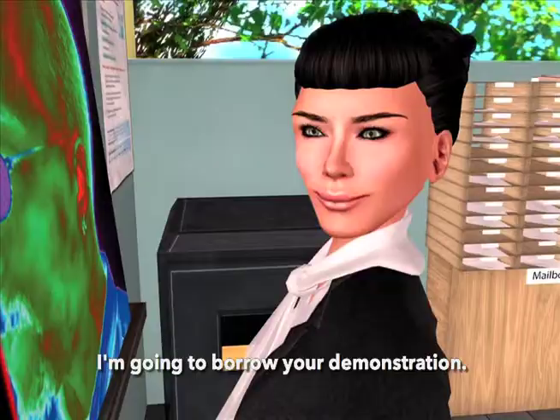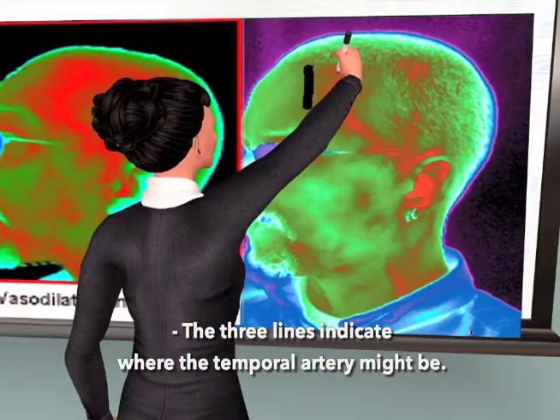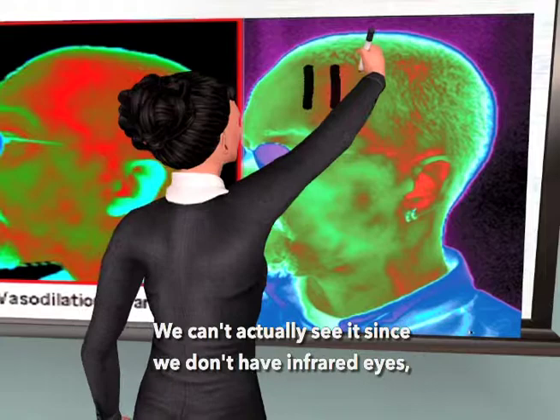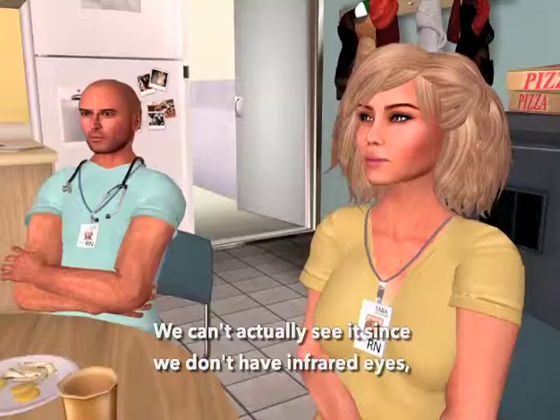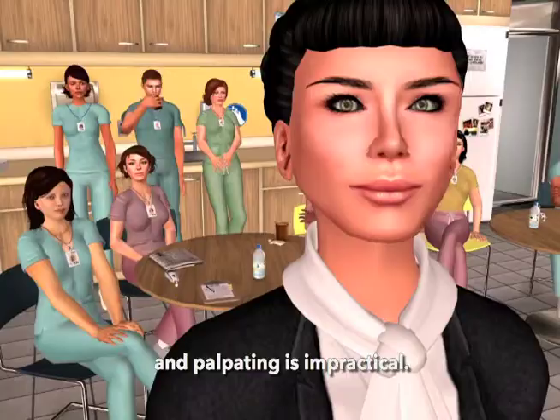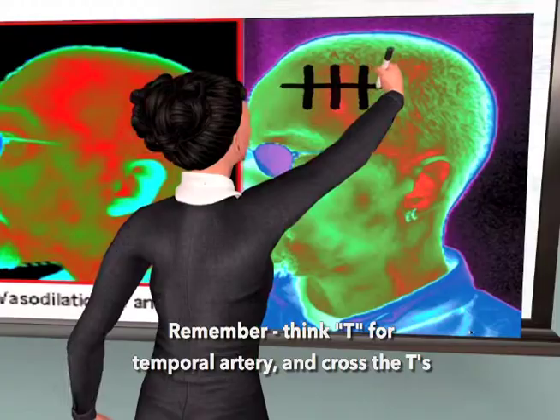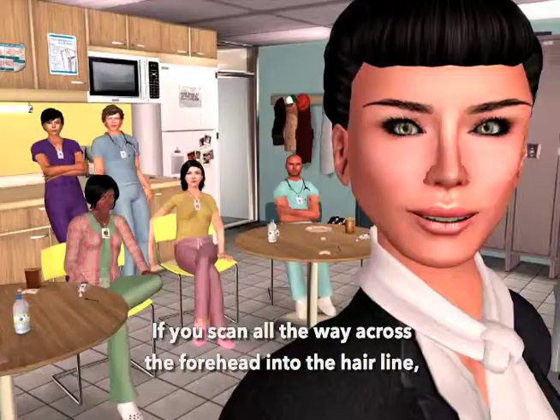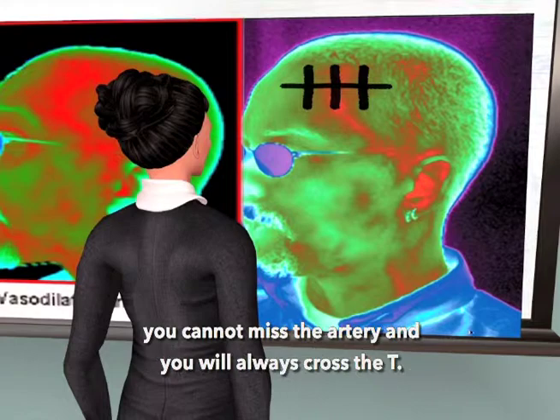The three lines indicate where the temporal artery might be. We can't actually see it, since we don't have infrared eyes, and palpating is impractical. Remember, think T for temporal artery, and cross the T's. If you can scan all the way across the forehead into the hairline, you cannot miss the artery, and you will always cross the T.